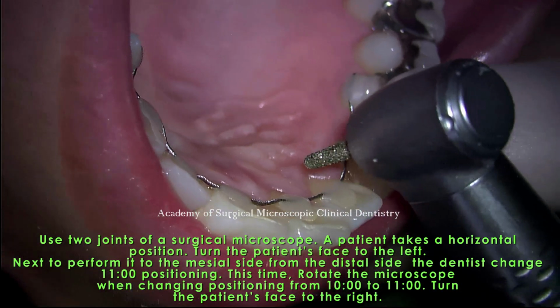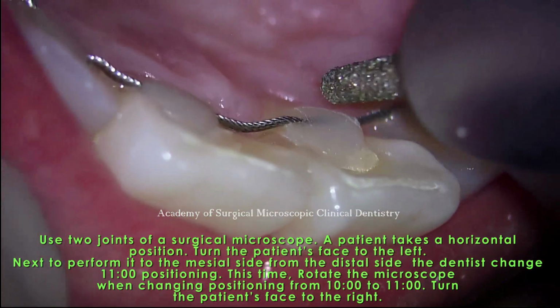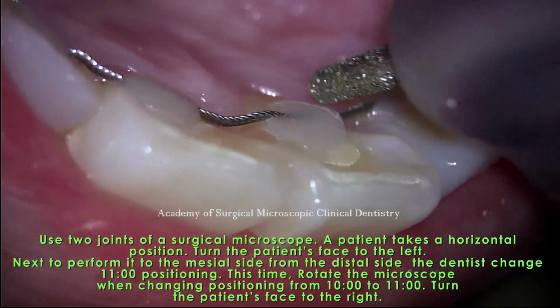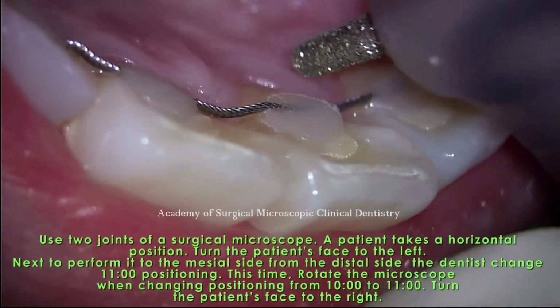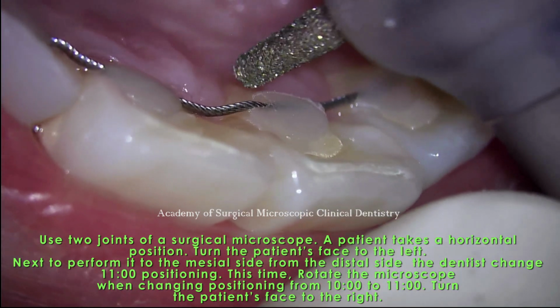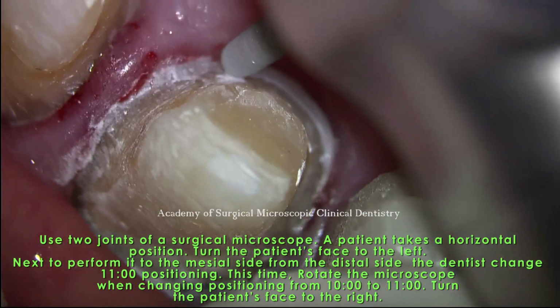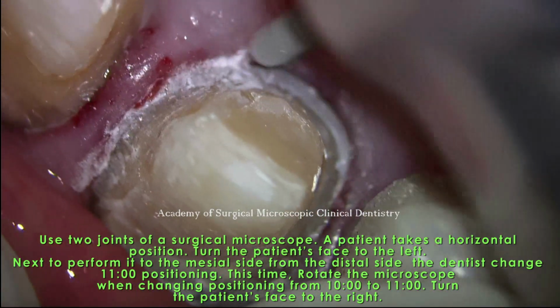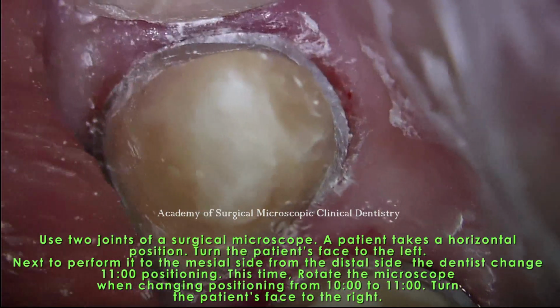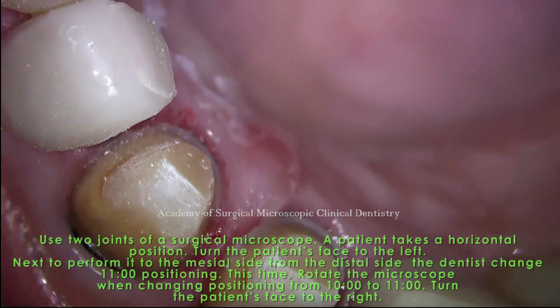positioning. Use two joints of a surgical microscope. A patient takes a horizontal position. Turn the patient face to the left. Next, to perform it to the mesial side from the distal side, the dentist changes to 11 o'clock positioning. This time, rotate the microscope. This is very important. When changing positioning from 10 o'clock to 11 o'clock, turn the patient face to the right.